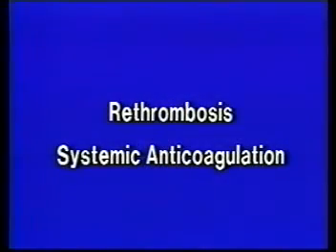Some practitioners have experienced reclotting during a long procedure. What recommendations can you make to address this problem? During a prolonged procedure, one may encounter rethrombosis of the graft. If this occurs, assess the patient's anticoagulation status by checking an activated clotting time. If the activated clotting time has fallen below 200 seconds, one should administer additional intravenous heparin.